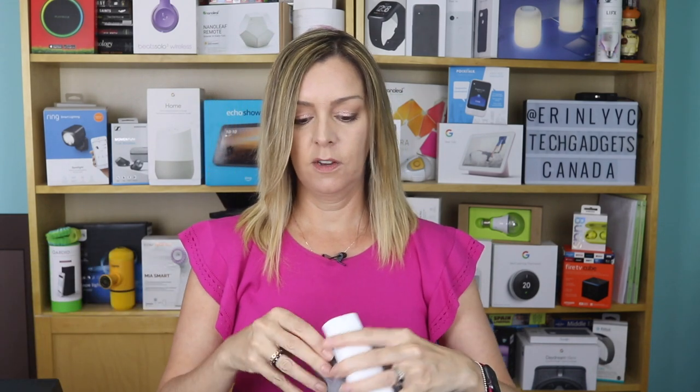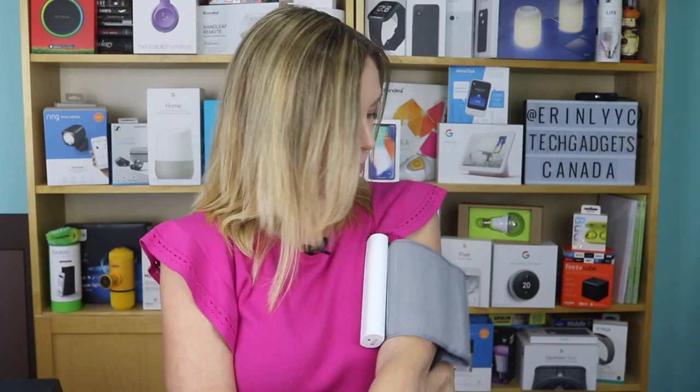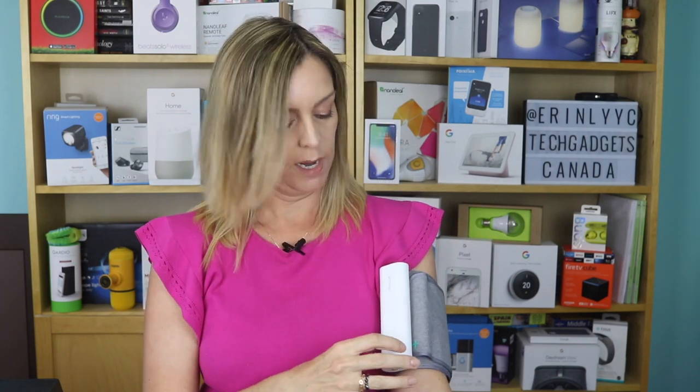So I've got the cuff. The cuff is adjustable and it works for a wide variety of arm sizes. So depending on how massive your biceps are, this should still be able to fit. You put this on — the device is meant to face the front of your arm and the button should go on the bottom end. Once it's on, you'll tighten the cuff. In terms of the actual operation of the unit, it's basically one button, one touch — you push the button once.